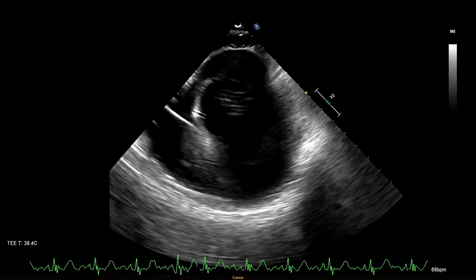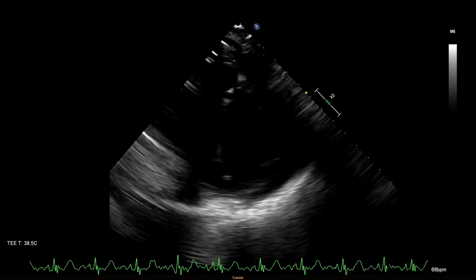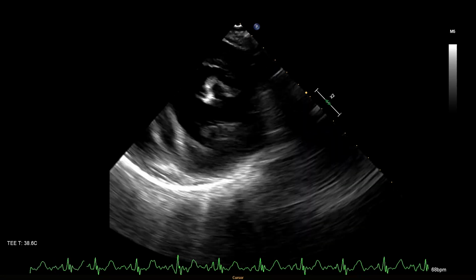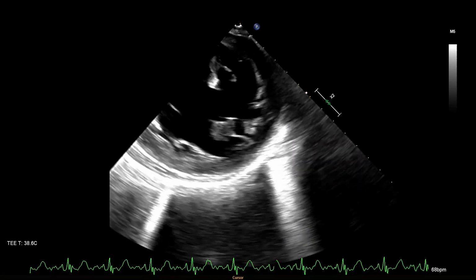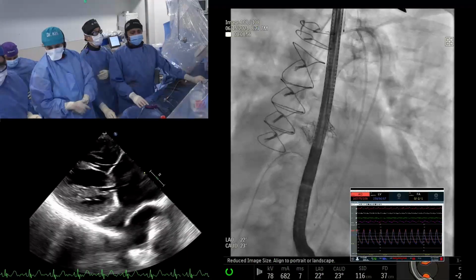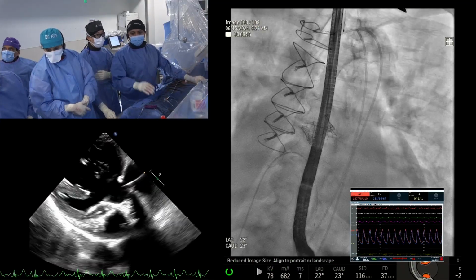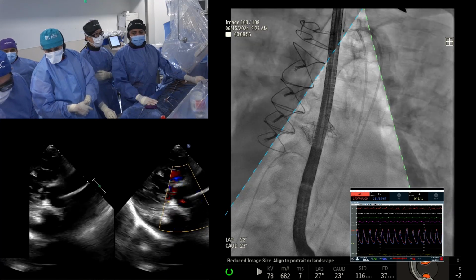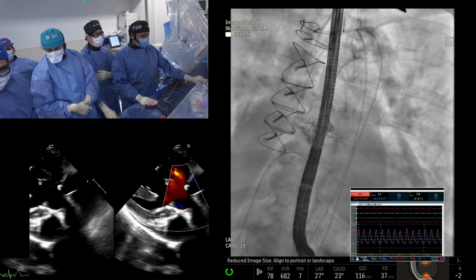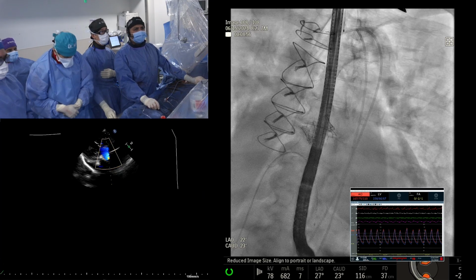Here it is 78% in the USA. Deploying about 8,000 TAVI valves per month here, about 78% market share is the Edwards. I know it's much lower there, with 50% being my valve, but otherwise it's a very good valve, very quick, dependable, as you can see. Not to say anything bad about other valves, because we started our life in the Medtronic CoreValve. Stam, can you put up the arch angiogram, please? Take that, thank you.